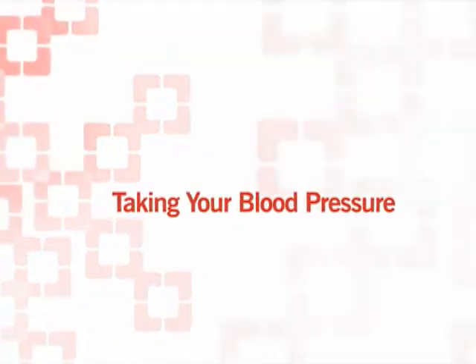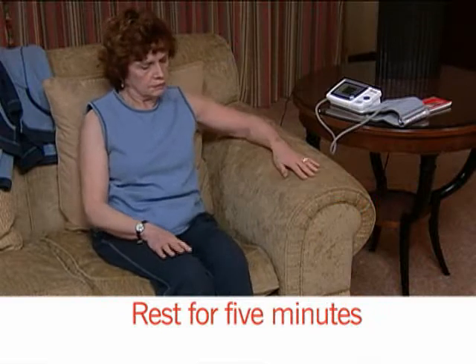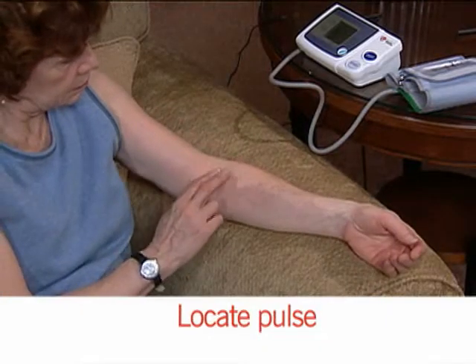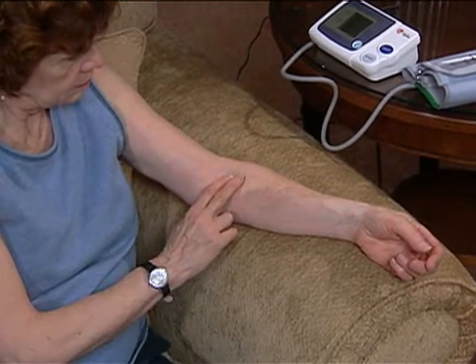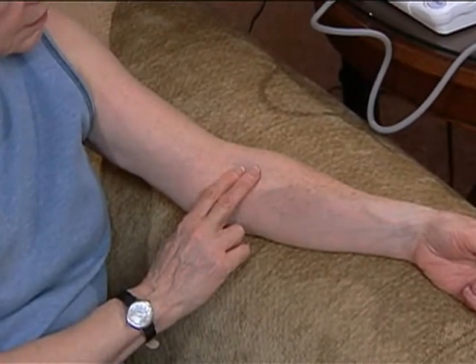Before taking your blood pressure, sit quietly and rest for 5 minutes in a chair with a backrest and with your arm supported on a flat surface. Your arm should be at the same level as your heart. Sit up straight with your back against the chair and your legs uncrossed. To begin, locate your pulse by lightly pressing your index and middle fingers to the inside center of the bend of your elbow. Here, you can feel the pulse in your brachial artery.